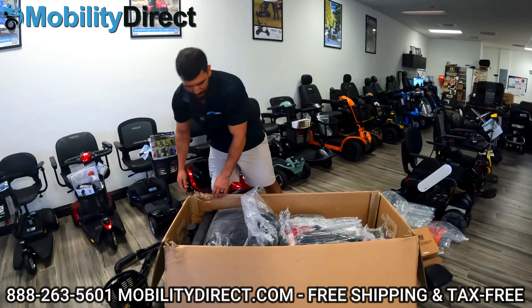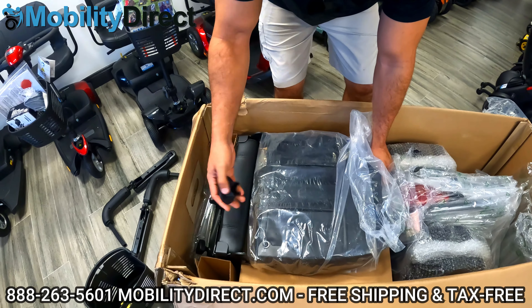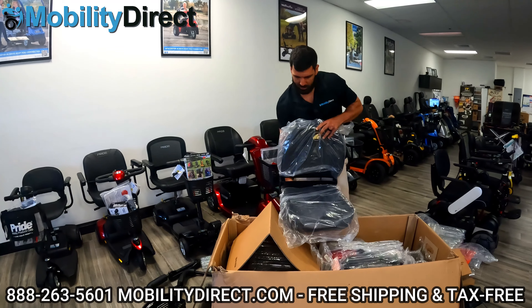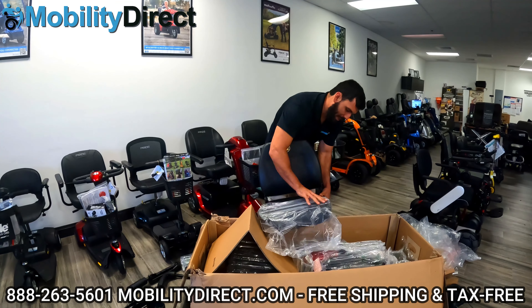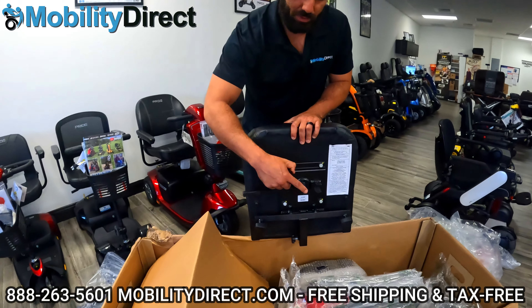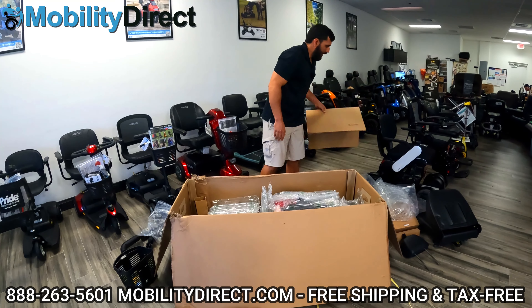It's a nice, comfortable captain seat. Unlike the Buzzaround Extreme, whose seat is comfortable but doesn't have the headrest and full back. Here's the seat — we have the backrest and the bottom part. There's a universal hitch receiver on the back with a little cover. I'm going to grab from where the screw is and pick straight up to remove the seat. Now you can see it's covered in some plastic. There's a little plastic cover you need to remove — that is the male connector on the bottom of the seat, which attaches to the height-adjustable seat post, which attaches to the base.